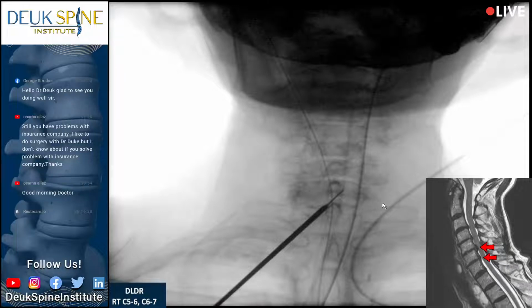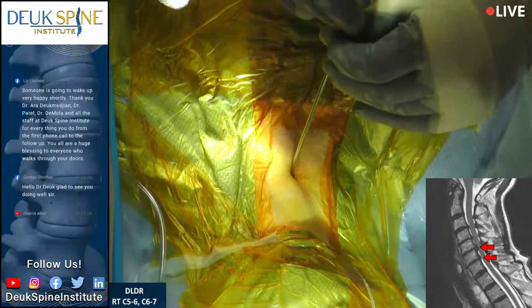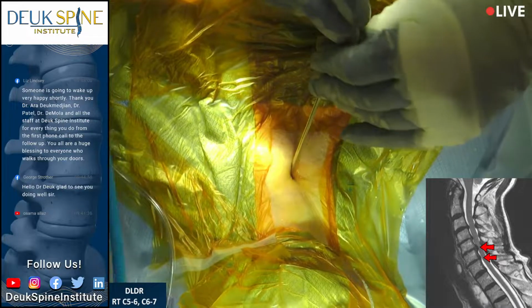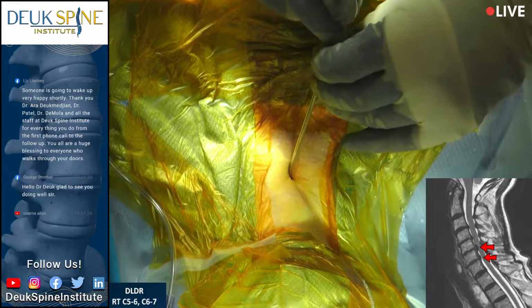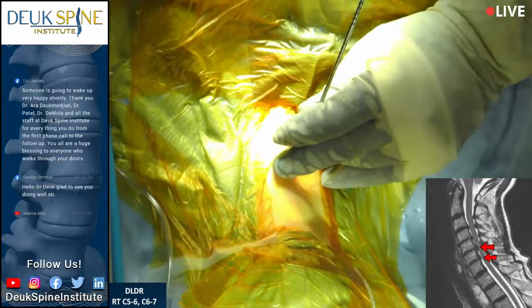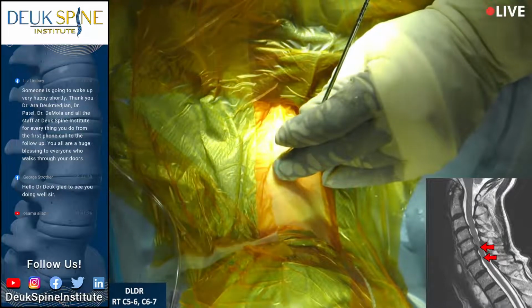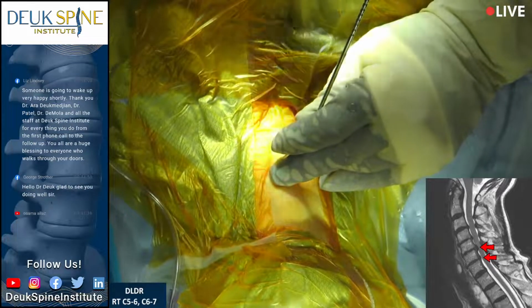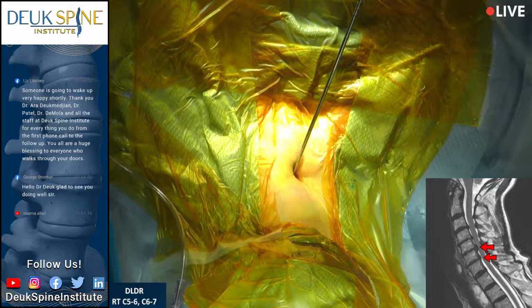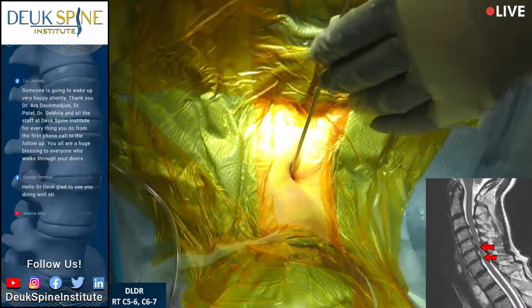You can see how small the incision is here, right, Flynn? 4 millimeters. Now I'm going to start entering the disc by just gently pushing the dilator in through the anterior longitudinal ligament. And once I get it entered into the disc, like I am now, I'm going to take my guide wire out and advance this dilator the rest of the way using my mallet. Some people freak out when they see the mallet, but the mallet is a very safe way of delivering force to the dilator.